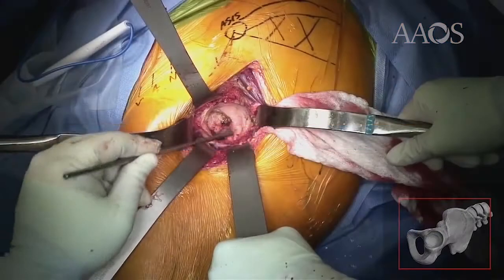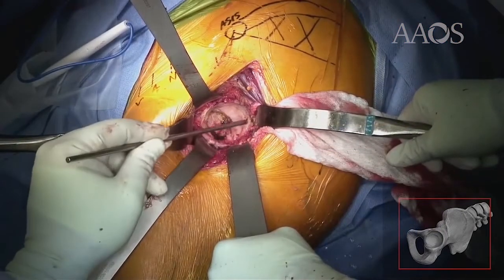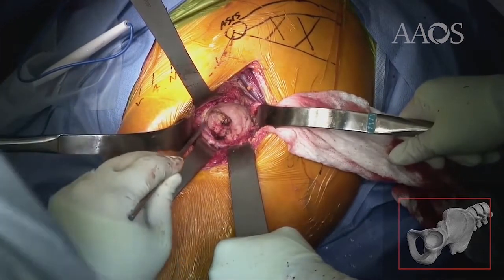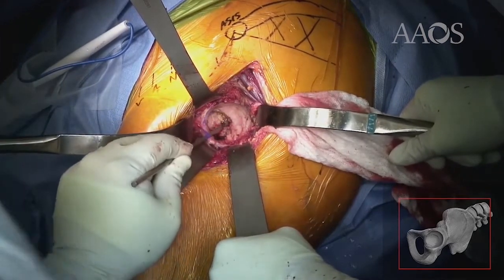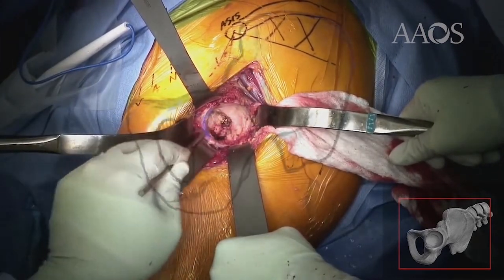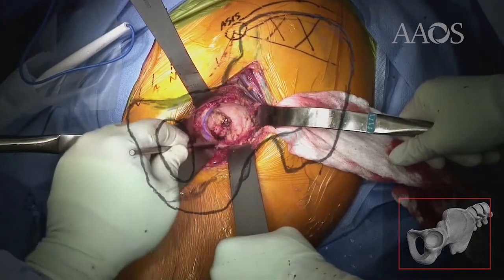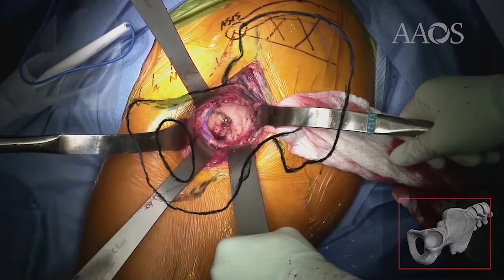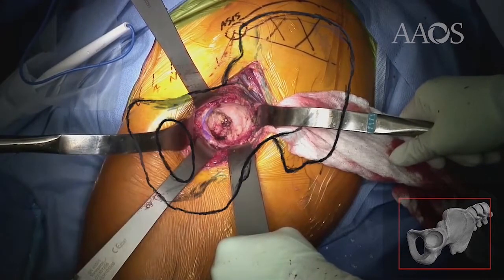We have access to the anterior and posterior rim, access to the cotyloid fossa and the medial wall, and here we're demonstrating preservation and identification of the transverse acetabular ligament.